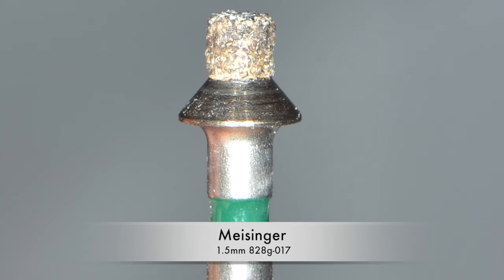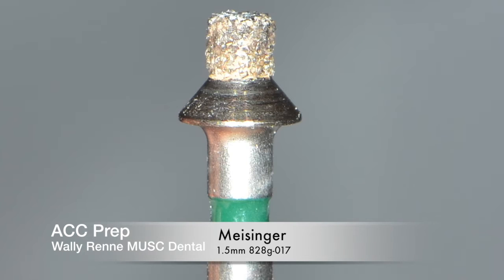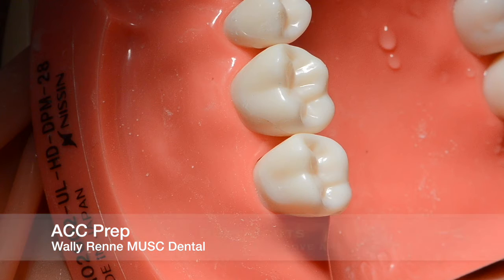We're going to go over the rough cut prep for the all-ceramic preparation. First, you're going to start with a depth cut bur — 1.5 or 1 millimeter depending on whether you're going to bond the restoration or whether it's a high-strength ceramic. If you are bonding and it is high strength, go with a 1mm depth cut bur, specifically if you're using Emax.